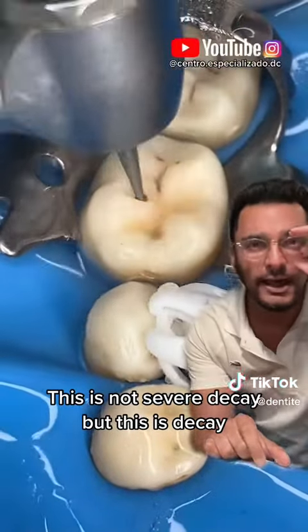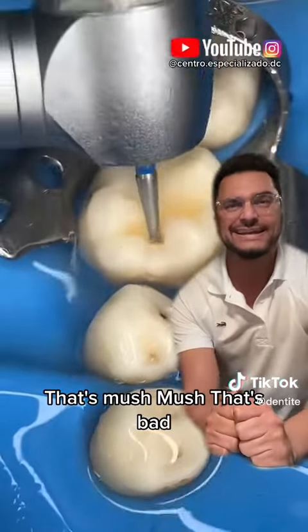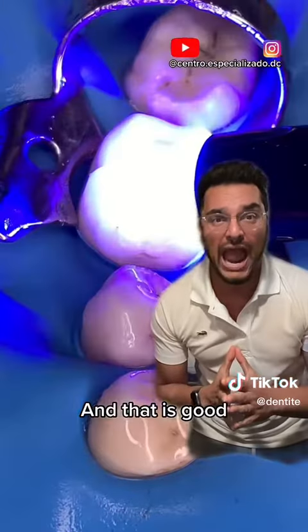This is not severe decay, but this is decay. All that dark brown, dark black stuff is bad. That's mush mush. That's bad. We clean it all out and we have yellow dentin — smooth as glass, and that is good. That's what you want.